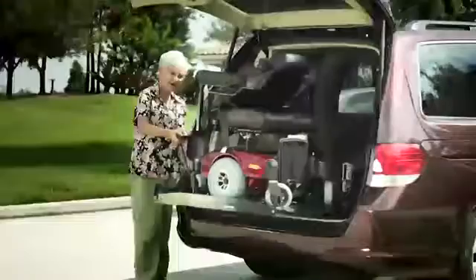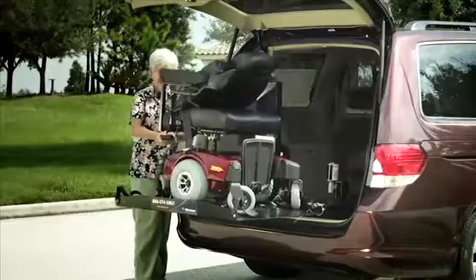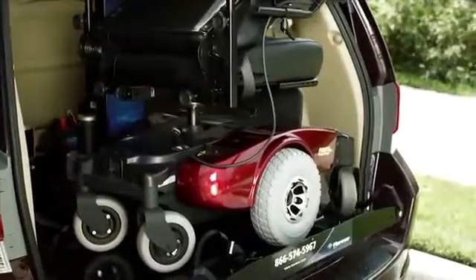With the AL600, there's no need for further vehicle or power chair modifications. So if you get a new vehicle, you can take your lift with you.